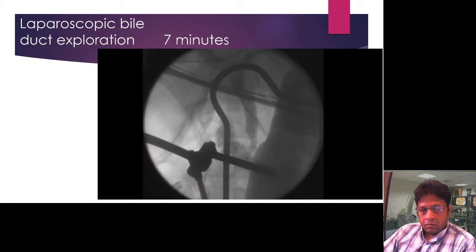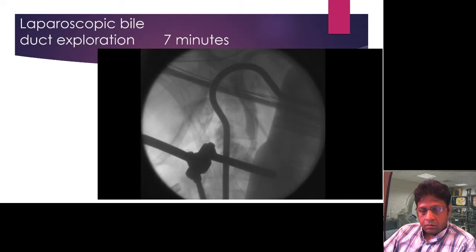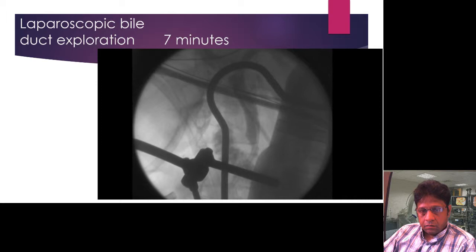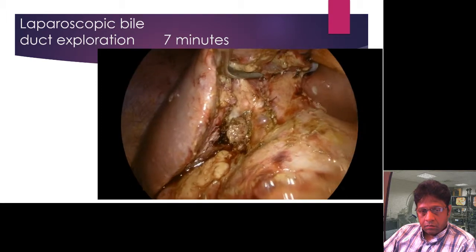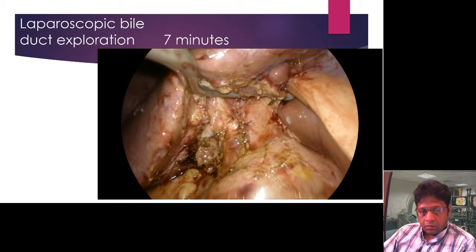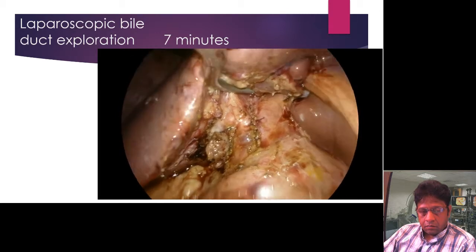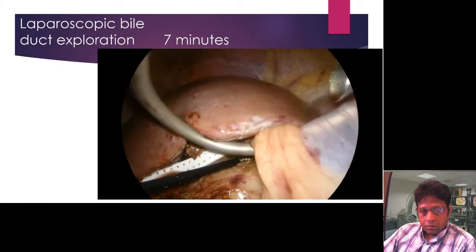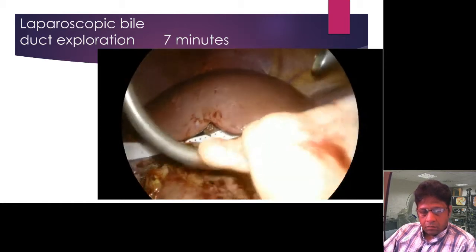On this occasion, a classic normal cholangiogram is achieved with no filling defects, filling of second order biliary ducts, and filling of the duodenum. The stent was left in place. The T-tube was removed, and the choledochotomy is closed. In this case, I did not leave a T-tube as the biliary anatomy was native, and the ERCP can always be performed again in the future should it be necessary.